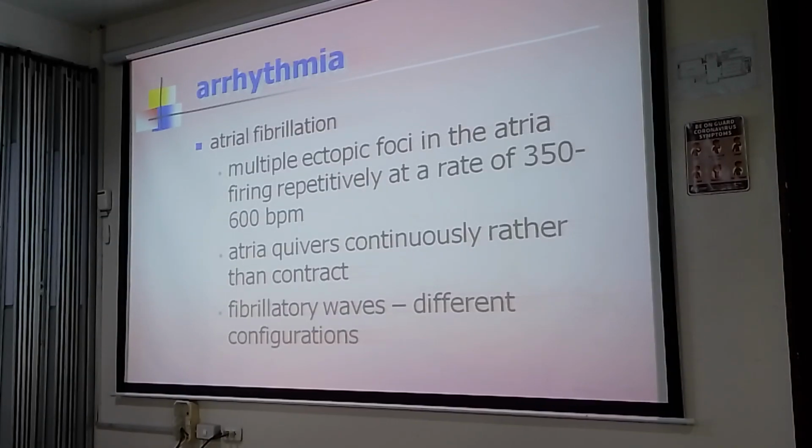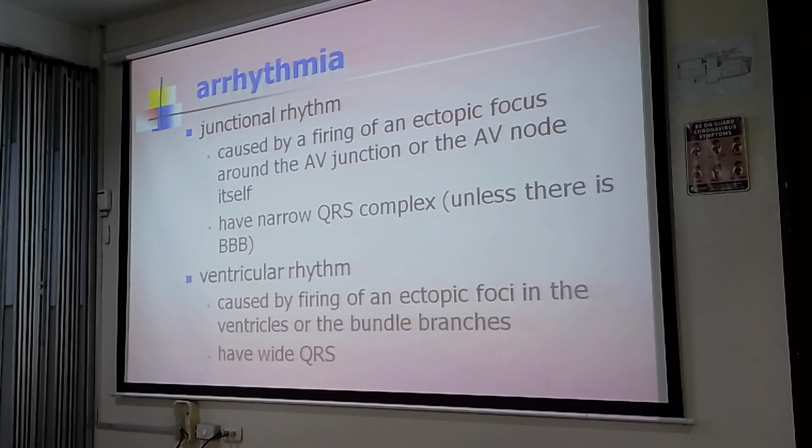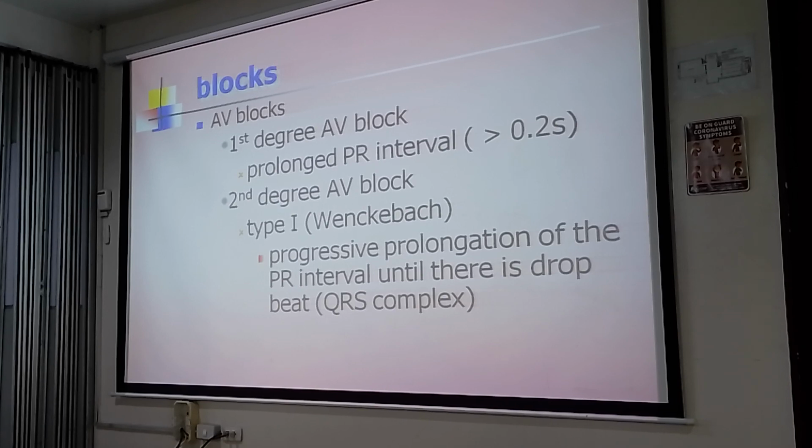And the arrhythmias, atrial fibrillation, I'll show you examples. So atrial fibrillation. I'll just show you atrial fibrillation. Blocks.